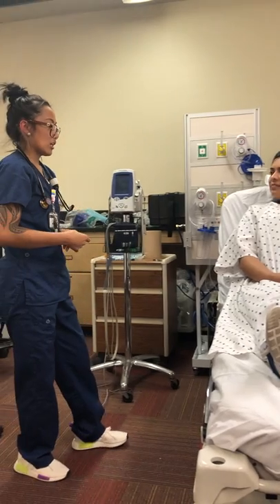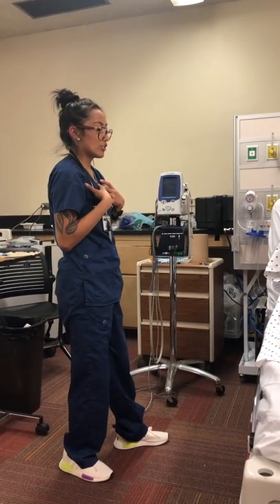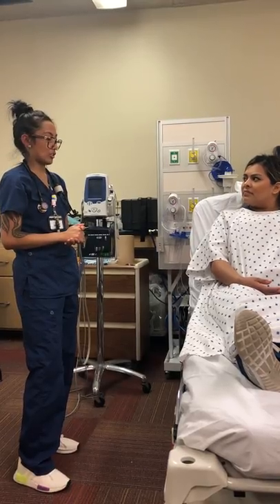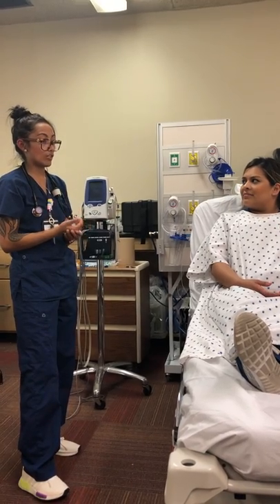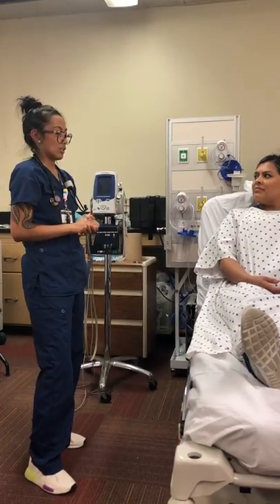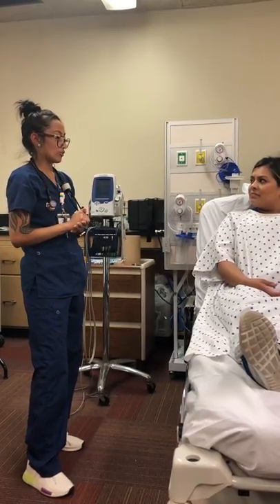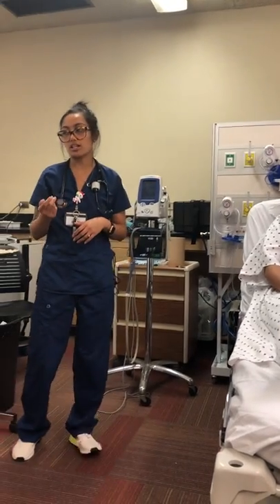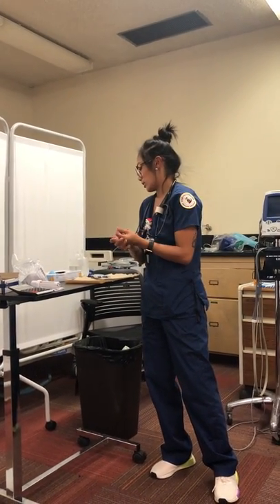So today, Julie, we're going to be taking your vitals and listening to your lungs because in your charts it does say that you have a history of asthma. We're going to see if you need the Duoneb administered to you that the doctor prescribed for your asthma. The administration of the medication will take about 10 minutes through the small volume nebulizer at 6 liters per minute with medical-grade oxygen from the wall at 50 psi. Is that okay? Since I gained the patient's consent, I will sanitize my hands one more time and place my gloves on to proceed.